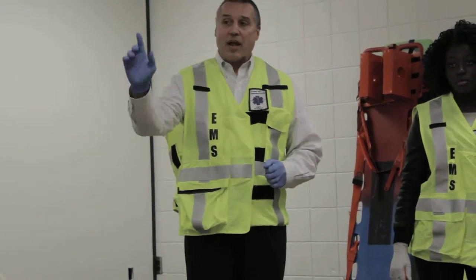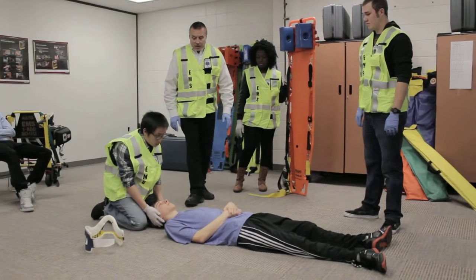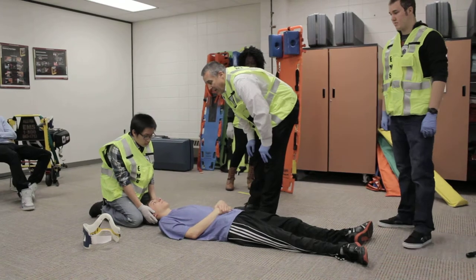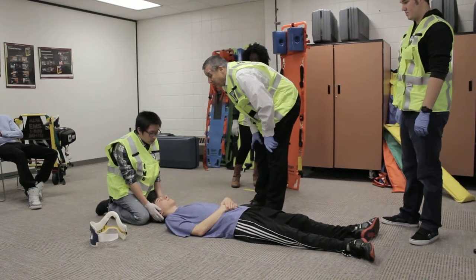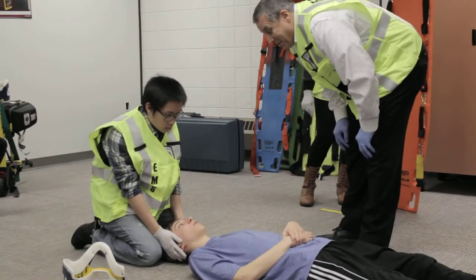My first thing is I'm going to have my partner come in and hold C-spine stabilization. Hello sir, we're EMS, we're here to help you. We think you might have a neck or back injury — I don't want you to move your neck or back. Just answer my questions yes or no. Okay?